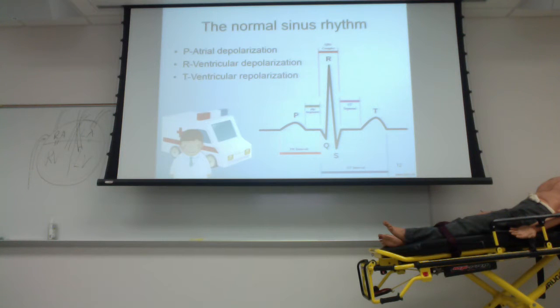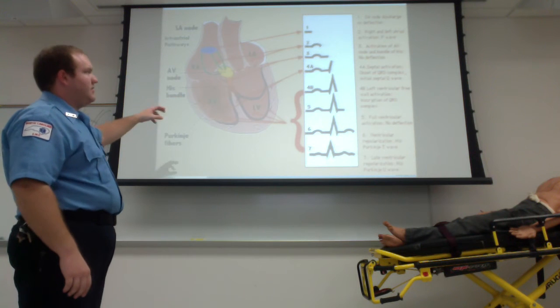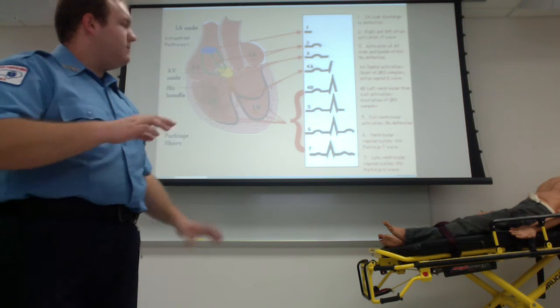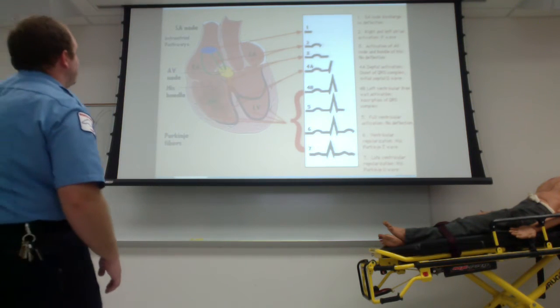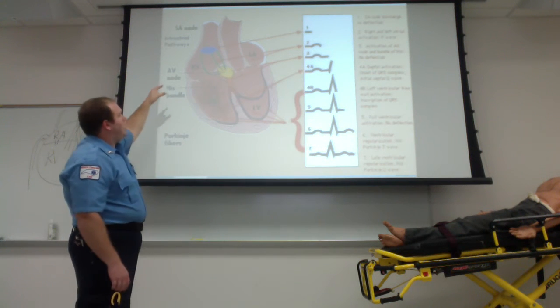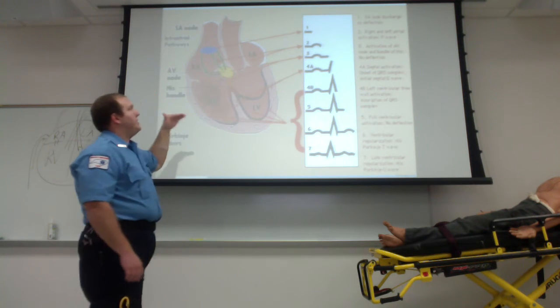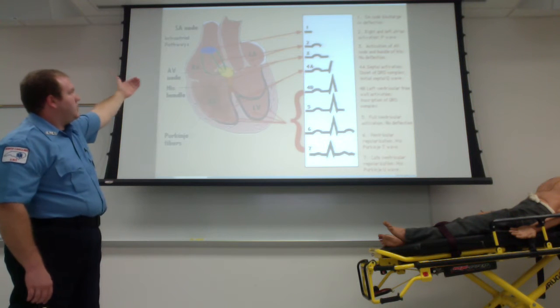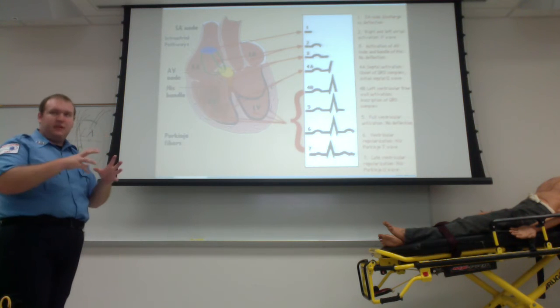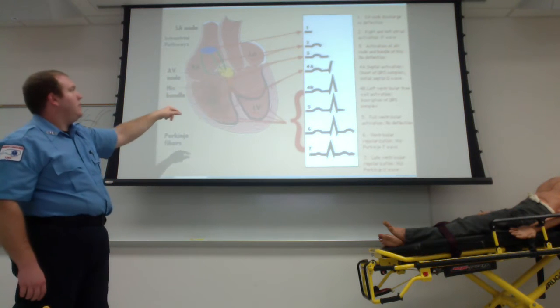This cycle here, I pulled this picture off another slide we had, and it relays those two ideas together. You see the way the action potential goes through the heart. Starting off at your SA node, you can see how that relates to the first portion, number 1, of your atrium getting ready to fire. Number 2, as they come through those green-brownish lines there, is your atrium getting their charge, depolarizing, contracting, and it is indicated by that first wave, the P wave.